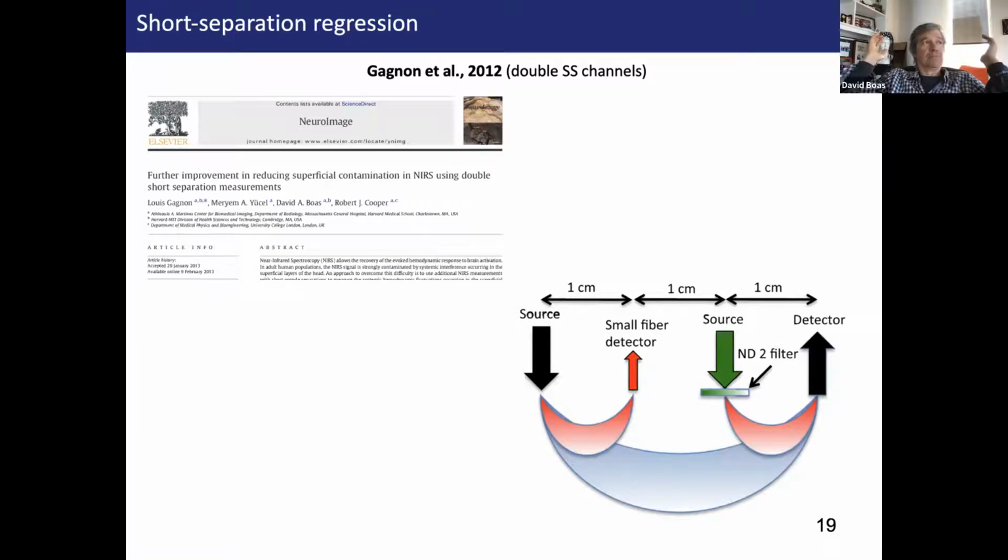I mean, get it close to your long separation measurements, right? That is probably the best guidance. But be more specific. Yeah, so I'm thinking about, say you have a reasonably dense array, then are you better suited to put your short source detector around the outside of your dense array, or maybe place a couple within the interior of your dense array?